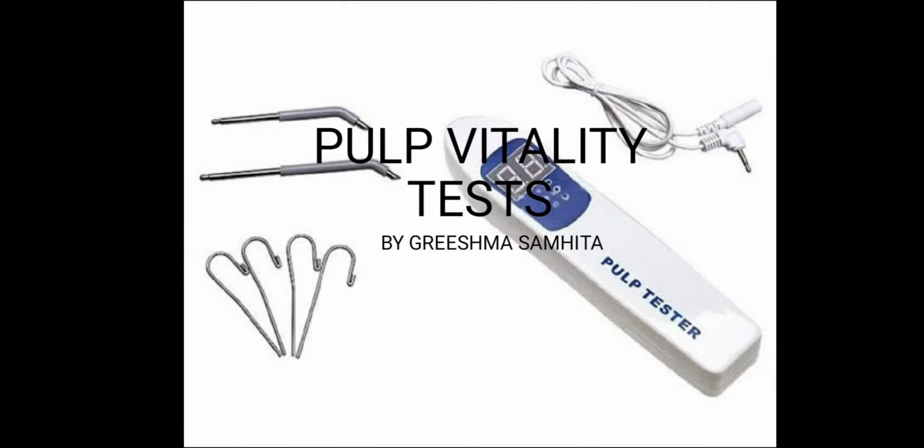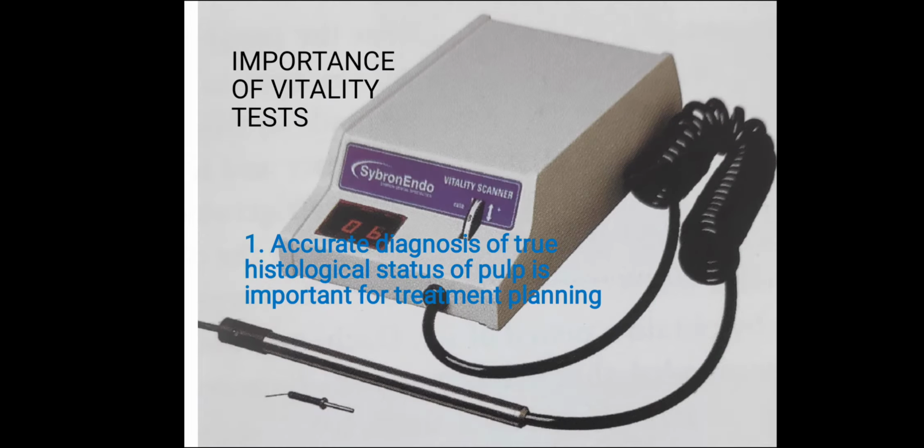Everyone, today let's learn about pulp vitality tests. So, firstly, what is the importance of vitality tests? It gives accurate diagnosis of true histological status of the pulp, which is obviously important for treatment planning.